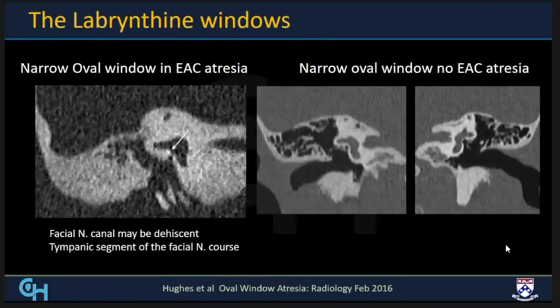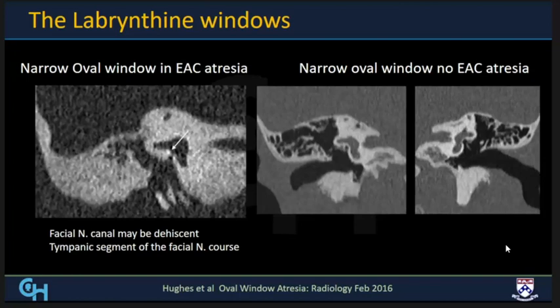Regarding the labyrinthine windows, specifically the oval window: in external auditory canal atresia cases, there is often narrowing or atresia of the oval window. When this occurs, the facial nerve tends to take a shortcut and travel inferiorly and more anteriorly. In some cases, the canal can be dehiscent and the uncovered facial nerve traverses across the oval window, with the stapes directly attached to it. If surgery is planned for stapes replacement, the facial nerve can be inadvertently damaged — so it is very important to highlight this anatomic course.